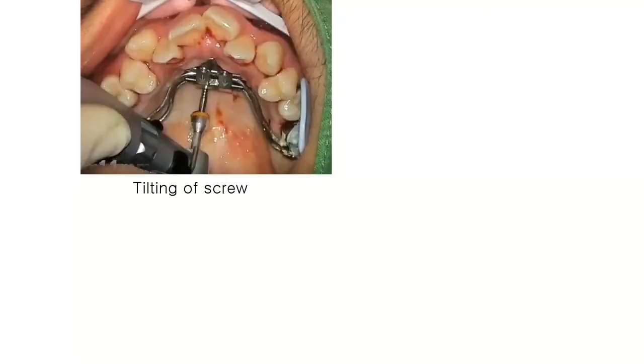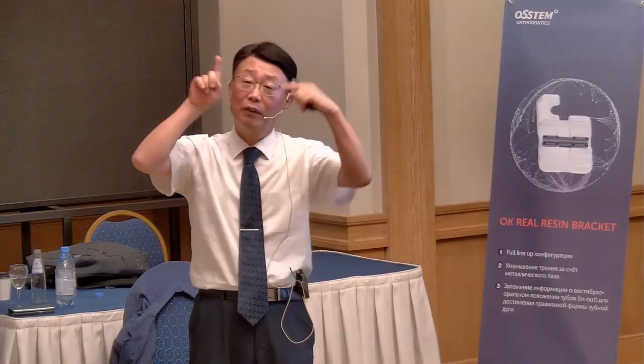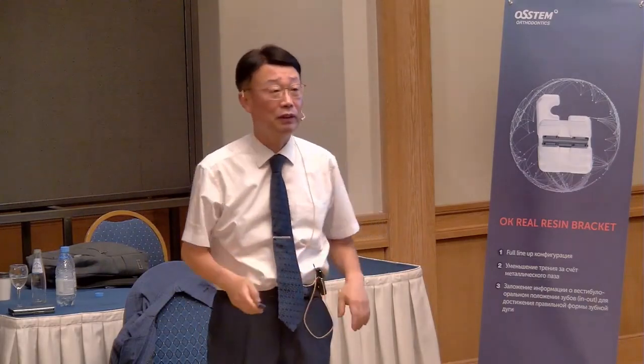And when you put on the 4 different mini screws with a handpiece, do not put on one side 100%. Like a field manual, you put on here and cross here and here, do not put on the same side; go in the opposite direction, go 90%, and we finish the rest of the 10%.